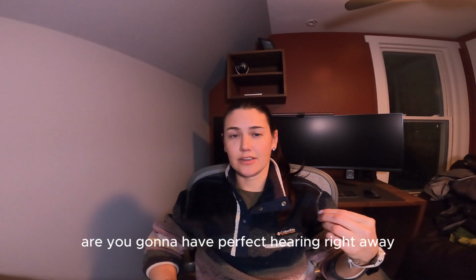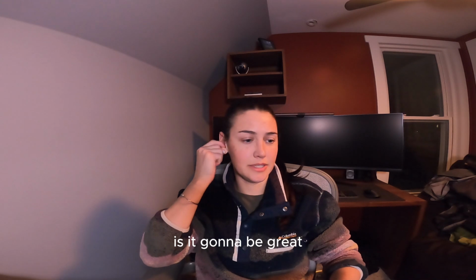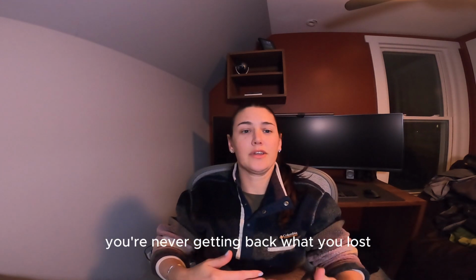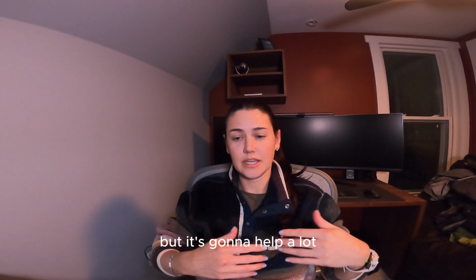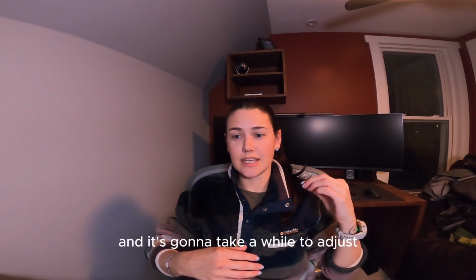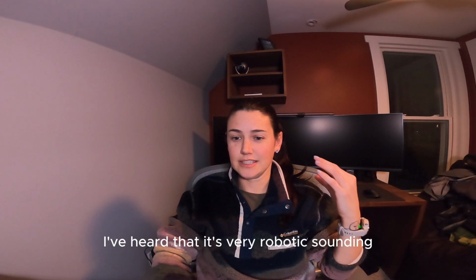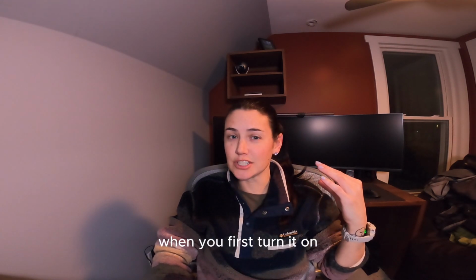People ask me, are you going to have perfect hearing right away? Is it going to be great? It's never going to restore what you have. You're never getting back what you lost, but it's going to help a lot, and it's going to take a while to adjust. I've heard that it's very robotic sounding when you first turn it on.